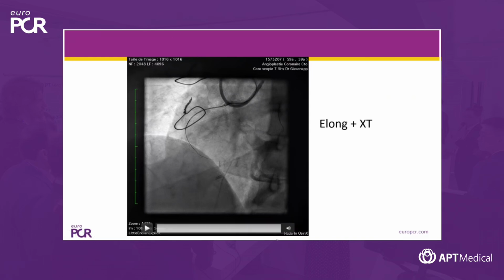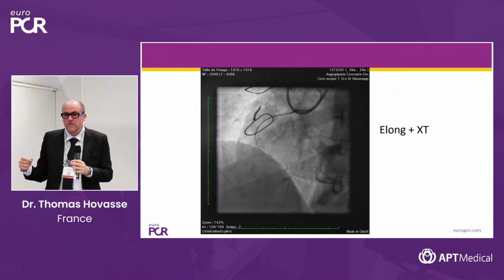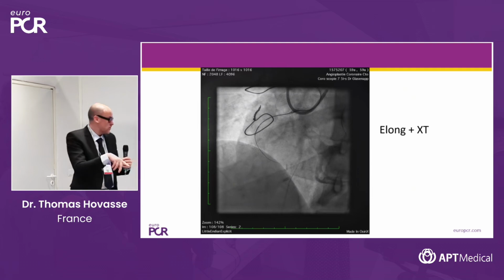So any of you have any experience with the Elong microcatheter? It's a very good microcatheter, I must say. It's a microcatheter you will manipulate counterclockwise to advance. And it's very strong against fatigue, so you can really rotate many times, as many times as you want. But all rotations should be anti-clockwise to advance it. And always, when you manipulate a microcatheter, don't forget not to use only the right hand, but use both hands to do the anti-clockwise movement to really transmit the force to the tip of the micro.